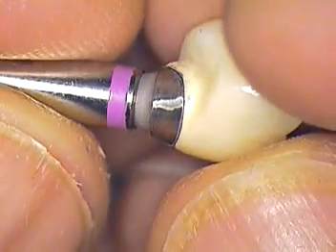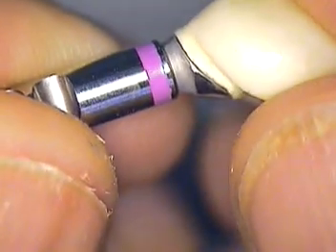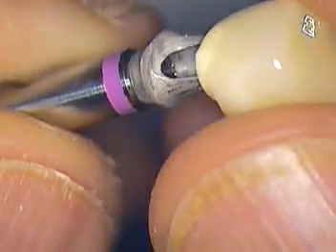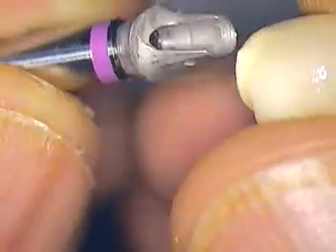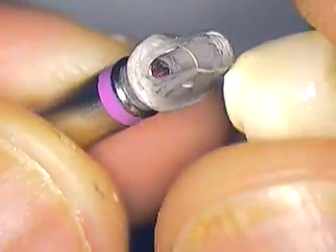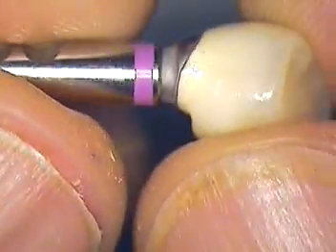I covered another section on just fit checking, but if I were to just tell you that this is fitting fairly close, I'll still fit check this case. The retention kind of bothers me a little bit — just having maybe a three-wall situation with a very short prep. Maybe it might have been better to go with a screw-retained here. We'll see how it goes.